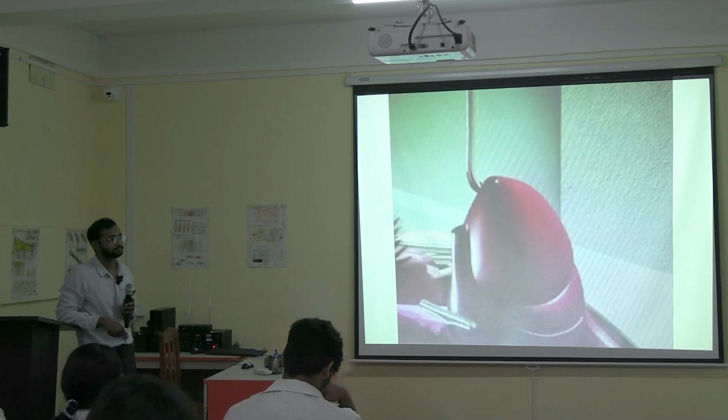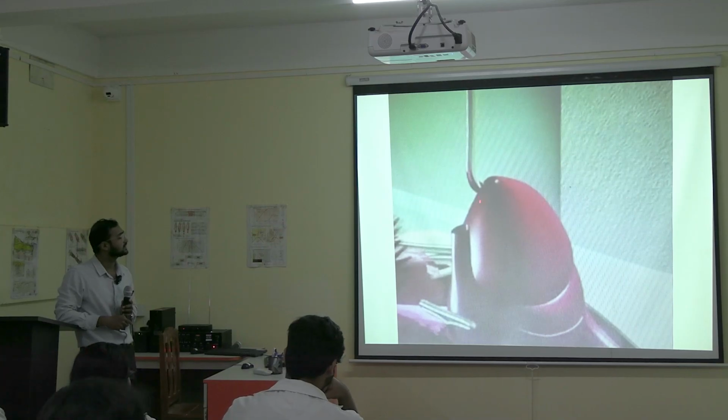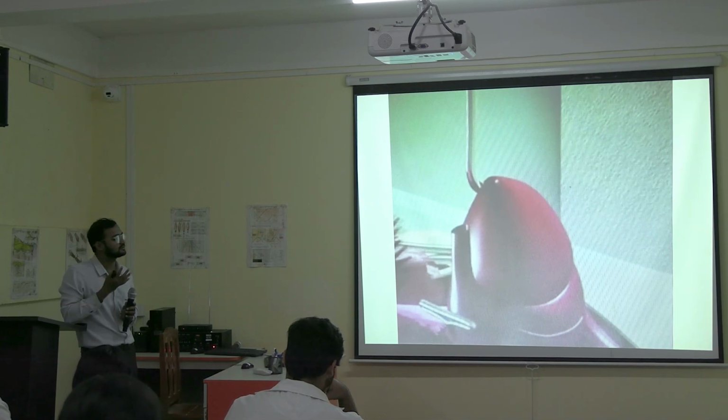What is the pericardium? What is its main function? Here we want to see how the contraction and relaxation of the heart look on a graph. Inside the pericardium there is a fluid-filled sac that helps in lubrication. The main purpose of removing the pericardium is so that we can see the graphical representation more precisely, as it appears to the naked eye.